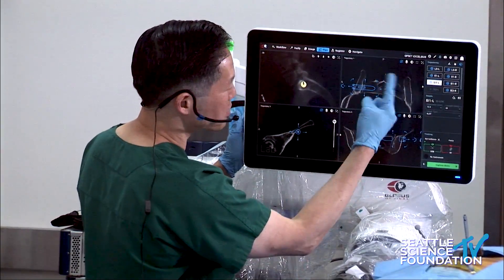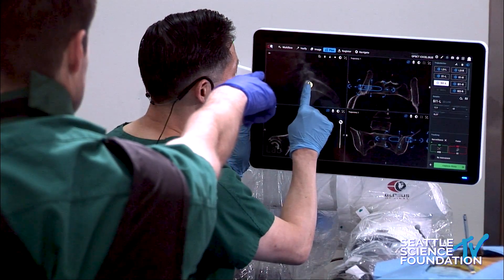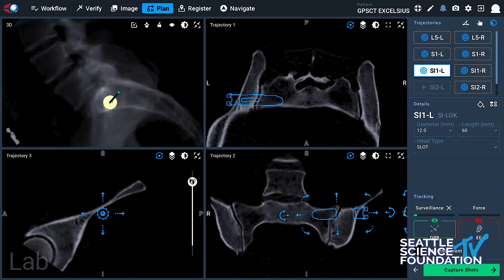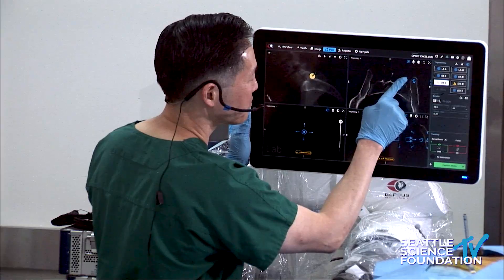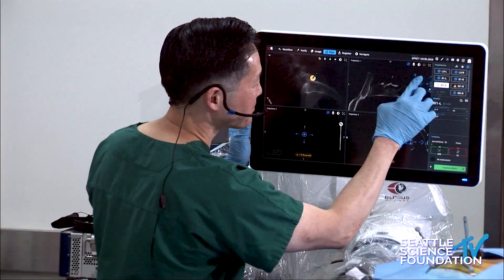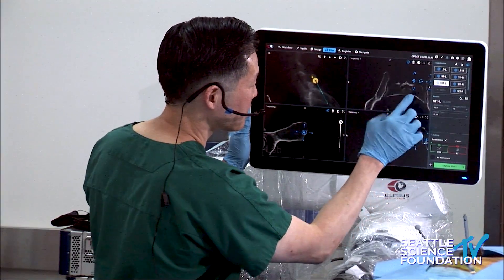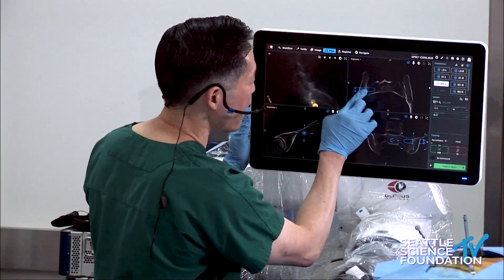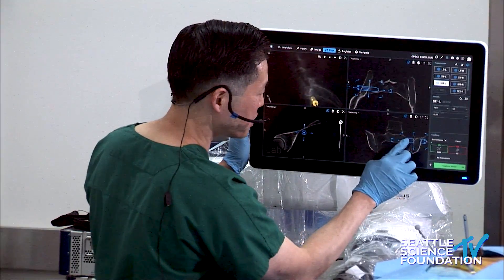I'll demonstrate — I don't have to wear lead, it's a very quick operation. The planning is where I find it can be a little bit of a challenge. You just drag the screw to where you want it. This was already planned; you can redrag it from the bottom. As you can see, you just drag it to where you want.